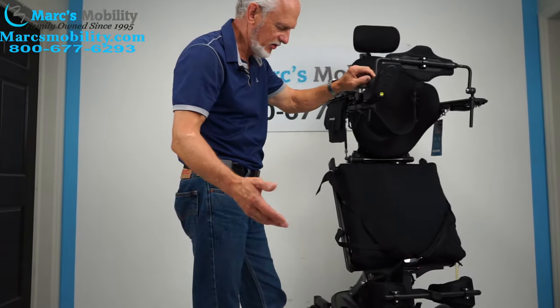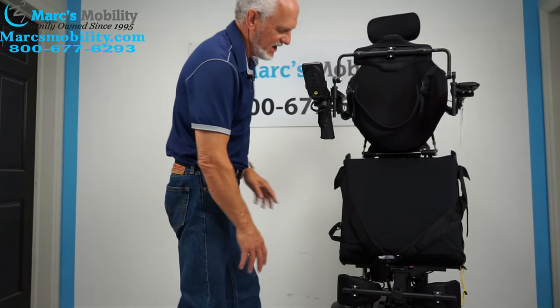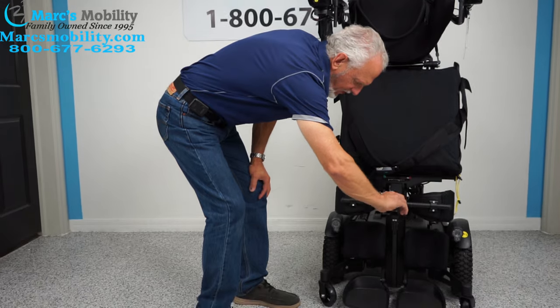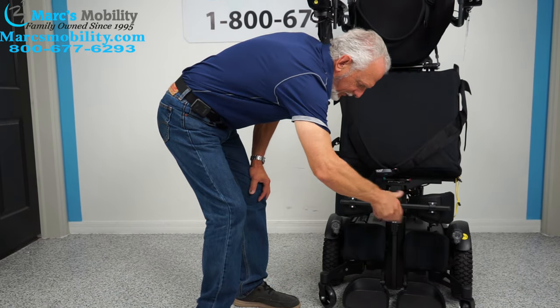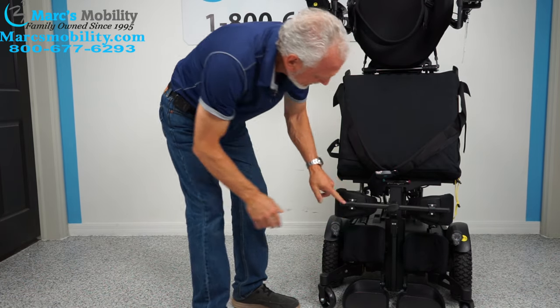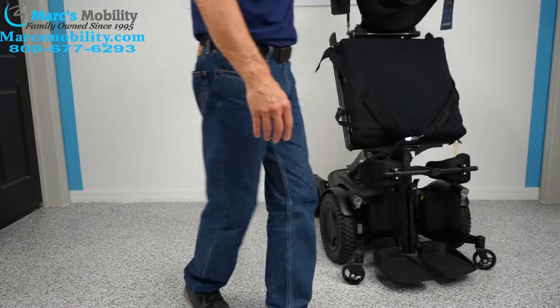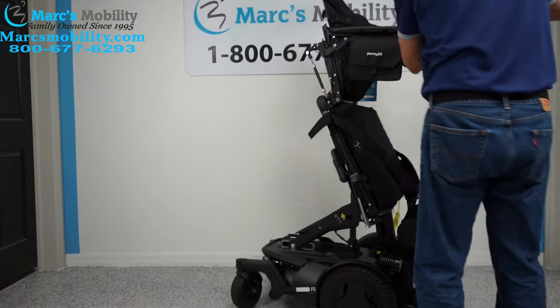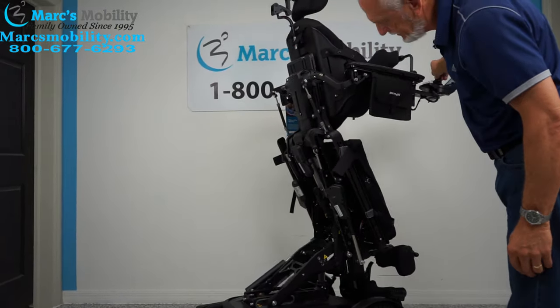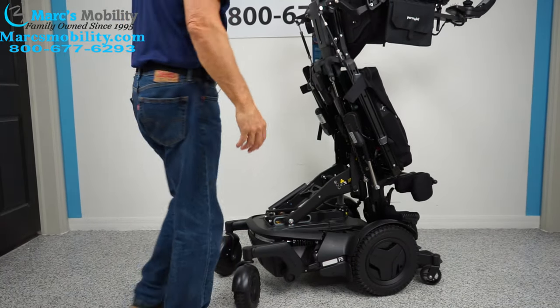You can drive this chair while standing at a much reduced speed. The front knee brace is adjustable — you turn this knob to bring it in or out, and you can see the screws there, all of that is adjustable. Let's turn it around so you can see how new the back of the chair is.